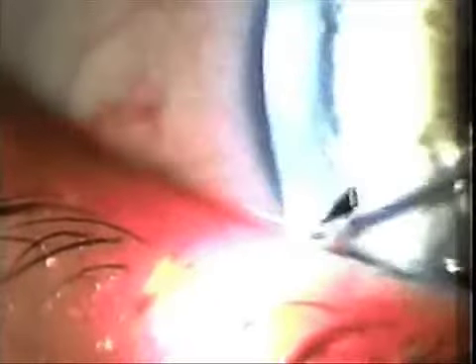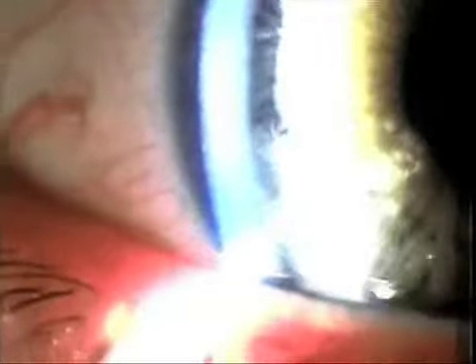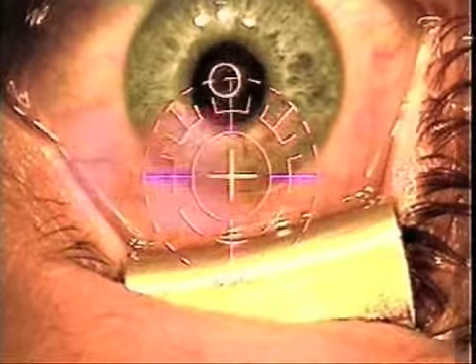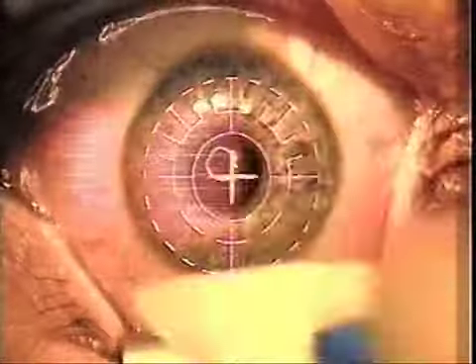It's easier to identify, especially if the patients are out a long time. We then use the second side of this instrument, made by Ryan for me, which is an enhancement tool, to create a small pathway underneath the flap so that it's easy to identify at the time of the surgical operation.